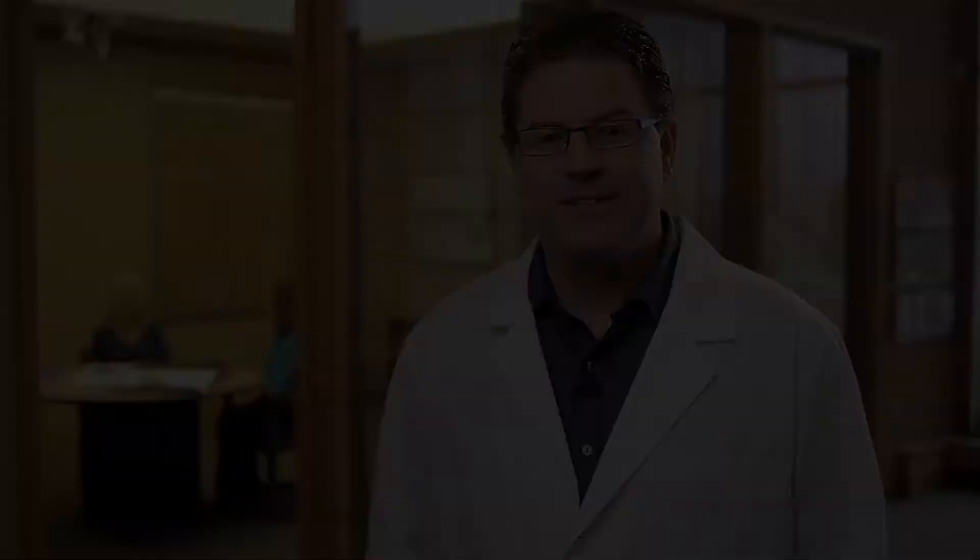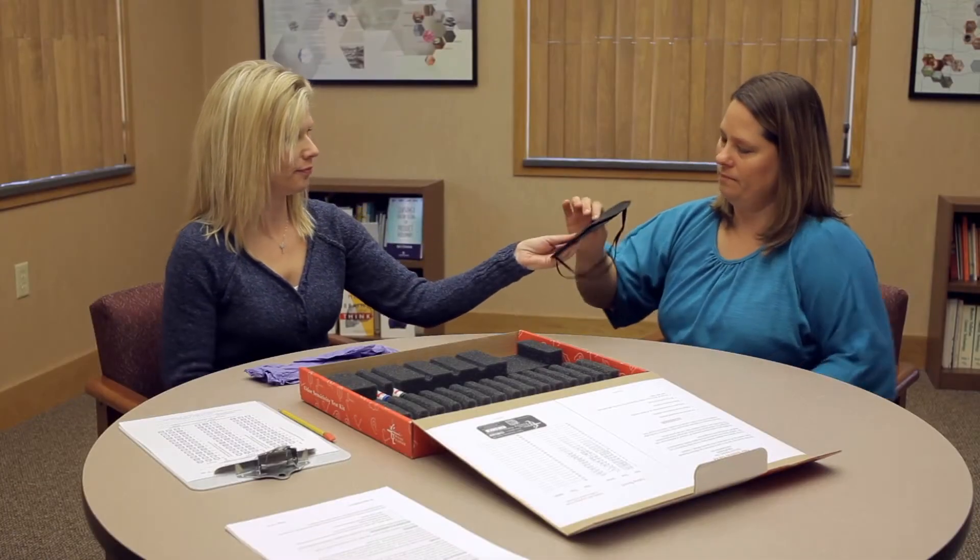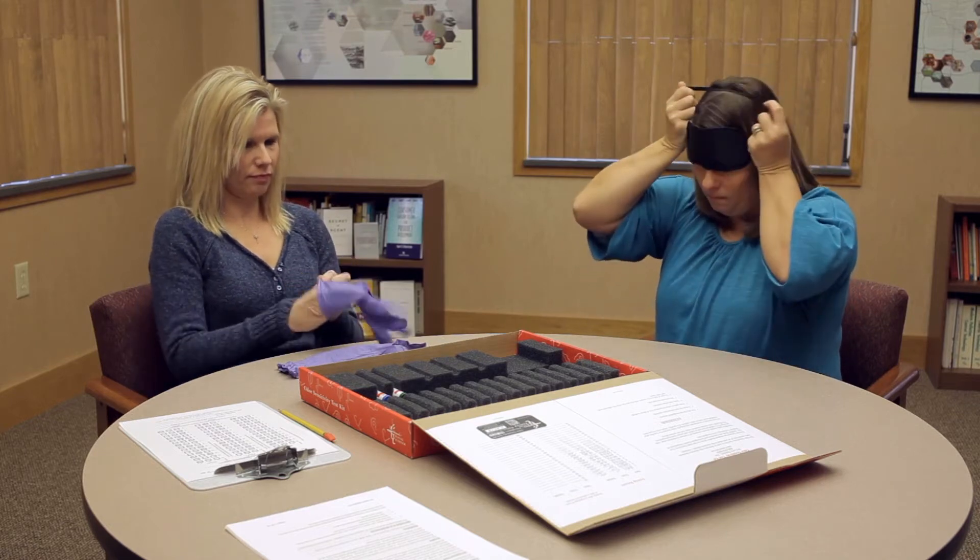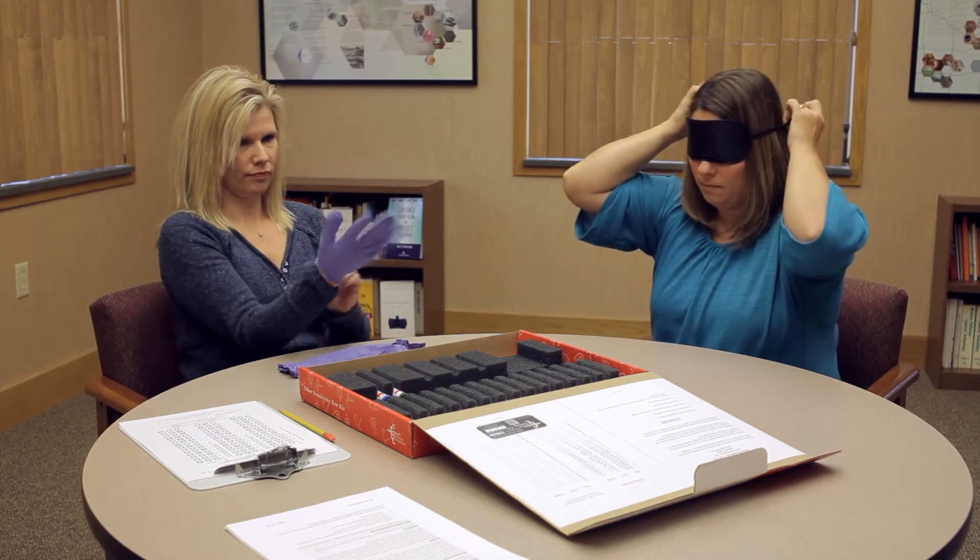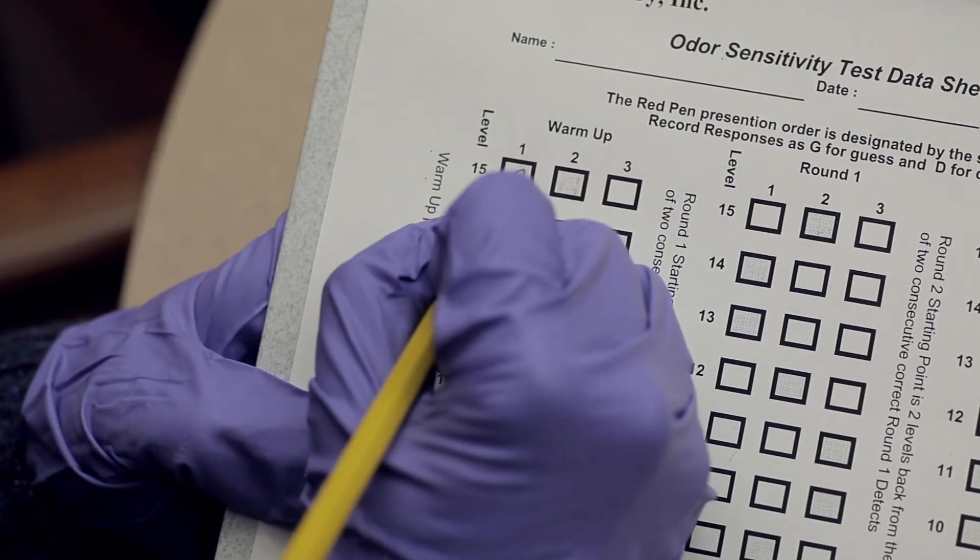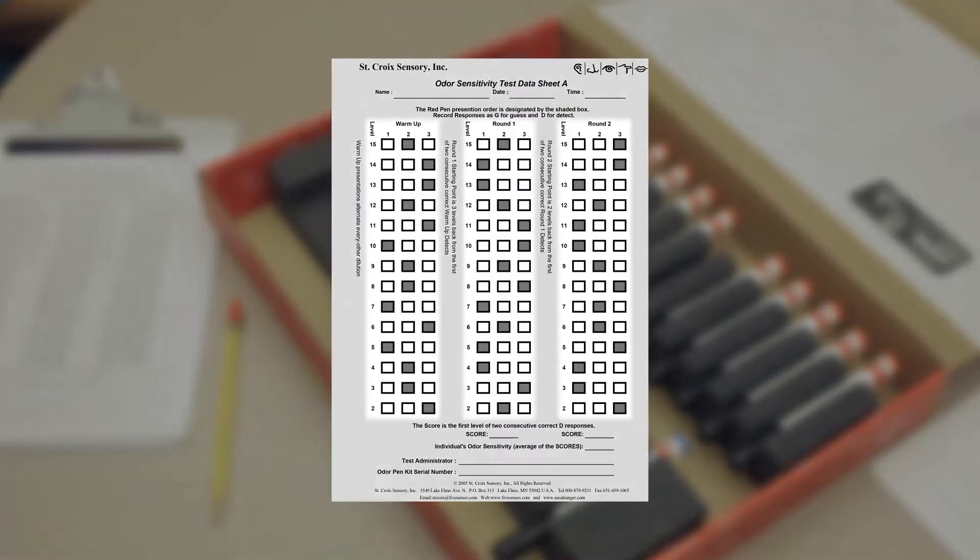Now, I'll walk you through the steps for administering the test. First, you will want to identify a quiet, odor-free space for testing. The test administrator will sit at one side of the table, and the test individual will sit adjacent.